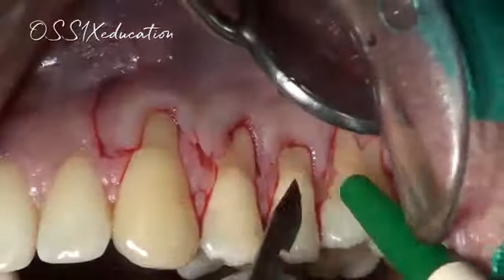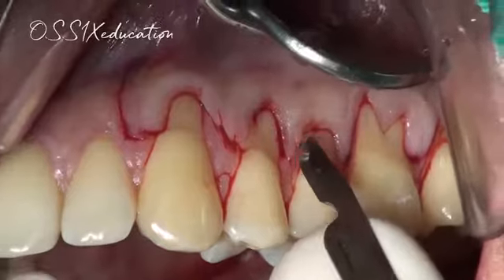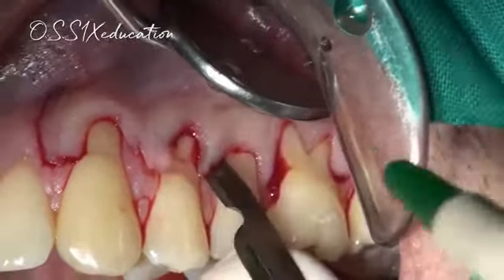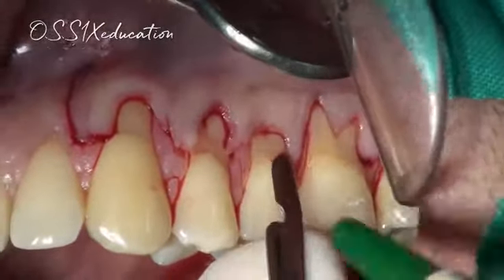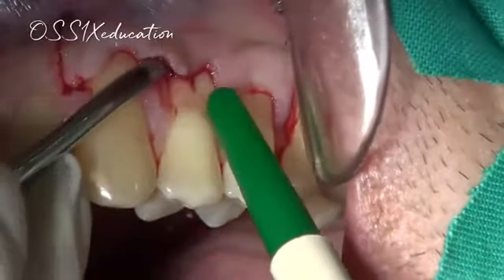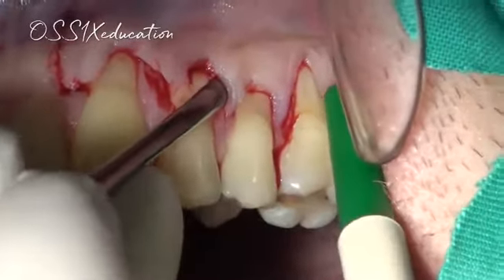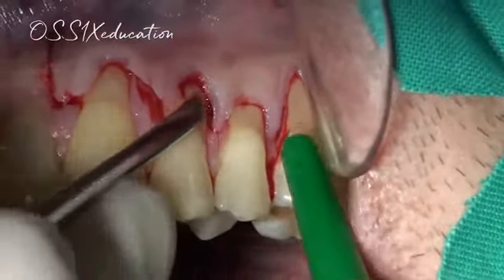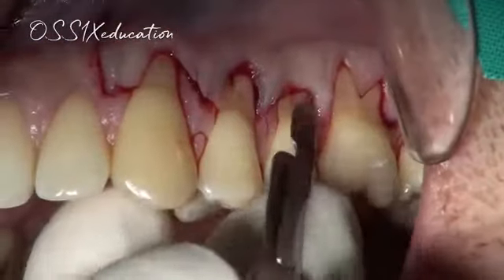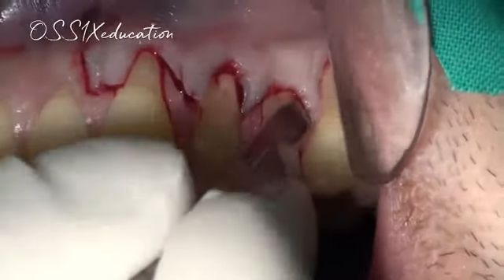It's unlike with the connective tissue graft, where the flap is split thickness all the way. When you place a scaffold like this, you want it to sit on the bone. At least that's my experience. So now we're raising a full thickness flap. We're elevating the surgical papillas that we have created, and we're gently elevating the flap, taking care to maintain the new surgical papillas.